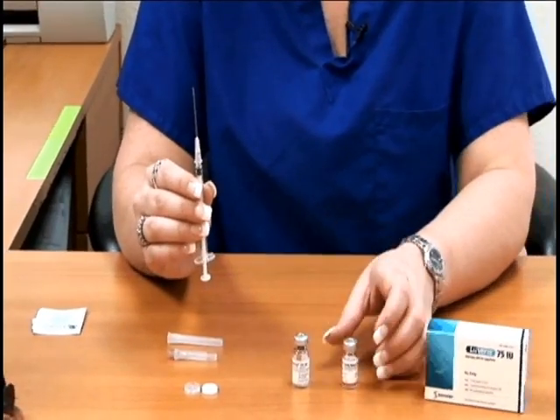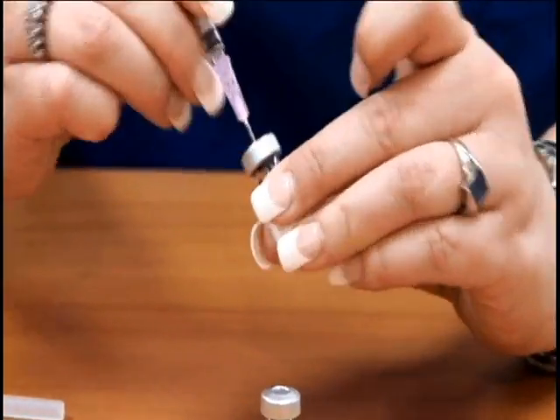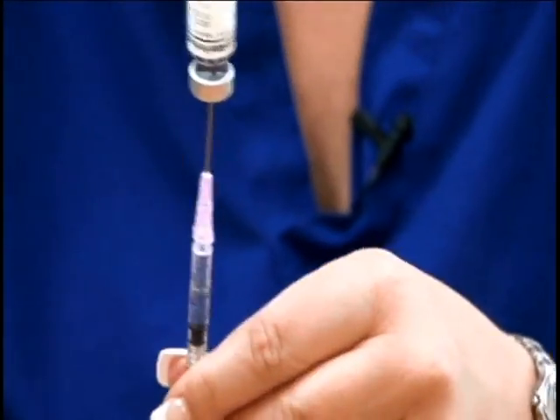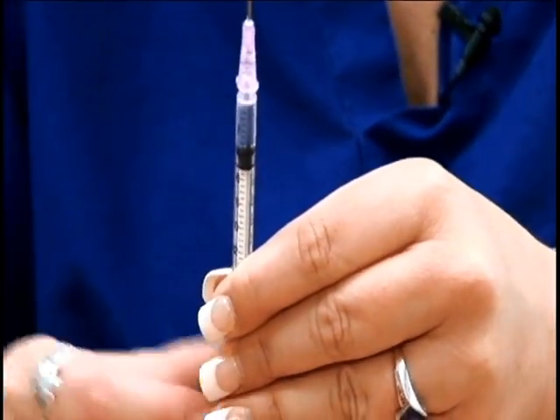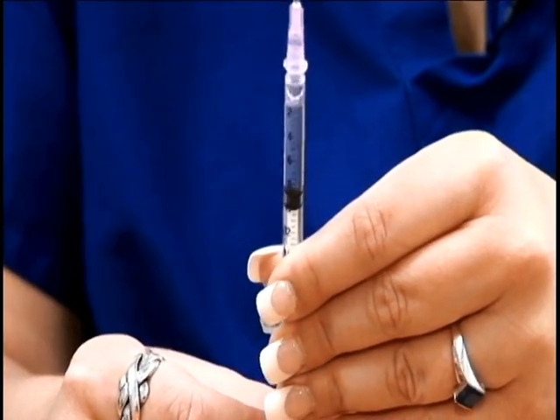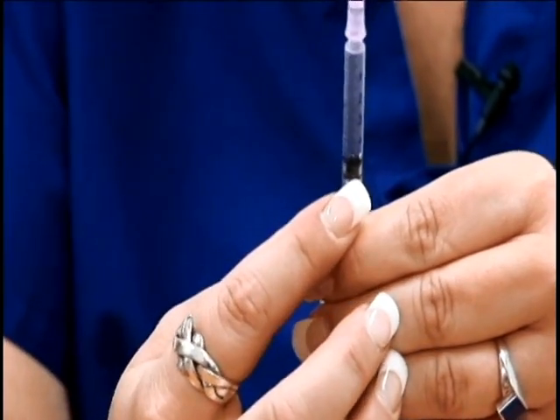Now you're going to take the sterile water and inject the needle into the vial. You want to turn it upside down and withdraw 0.5 ml. And this is the 0.5.